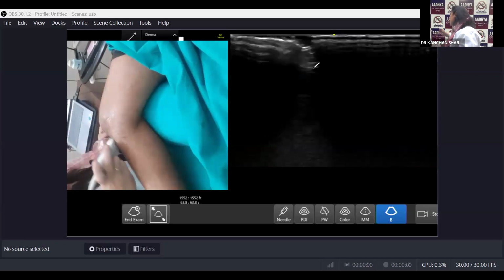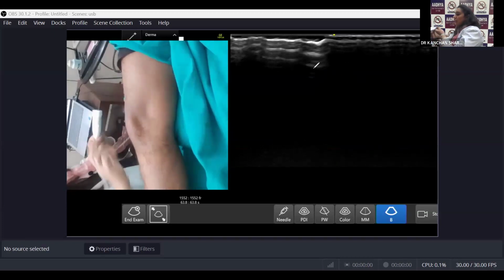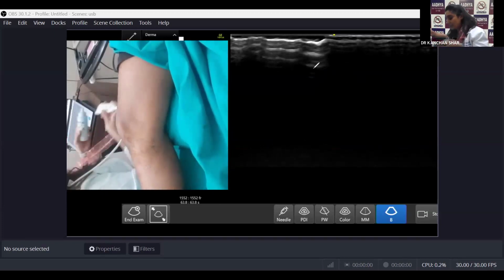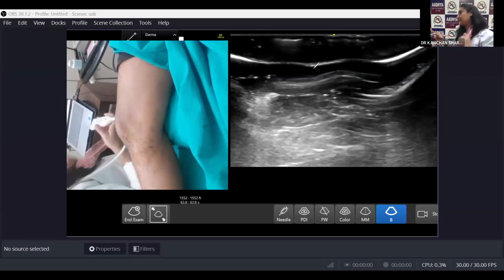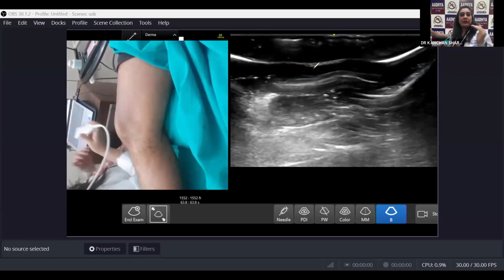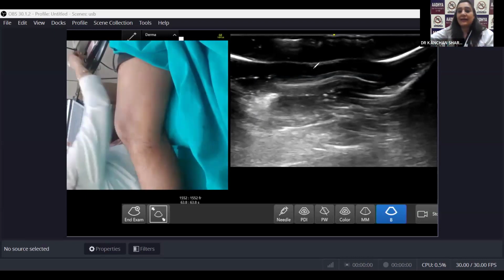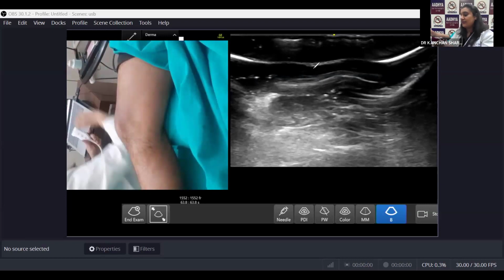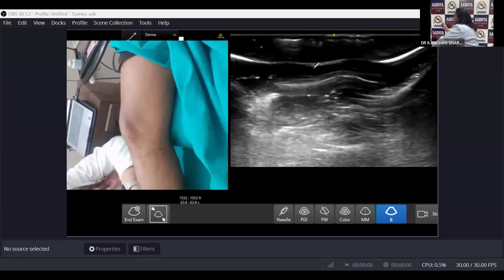So I was actually showing you somewhere here. Okay. When we were looking at the quadriceps tendon in the short axis. So we have two fat pads, suprapatellar fat pad. How exactly the things? Okay, I'll show you in the sagittal section. As it's straight.